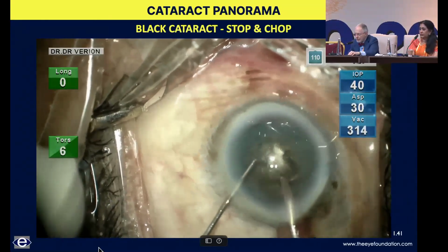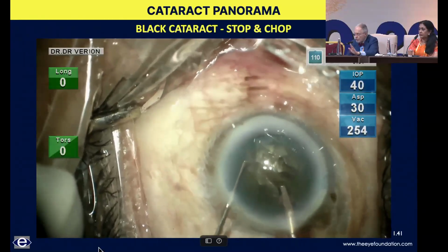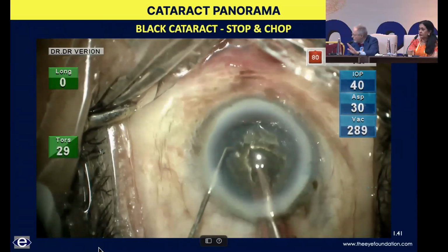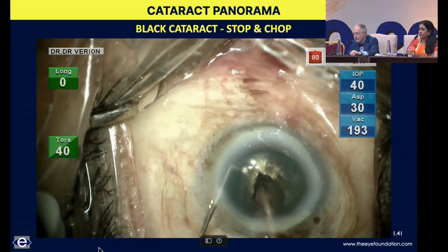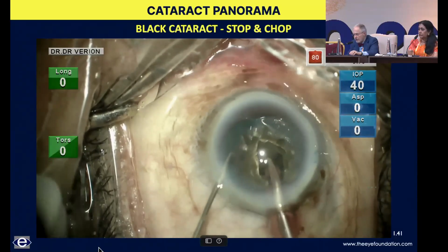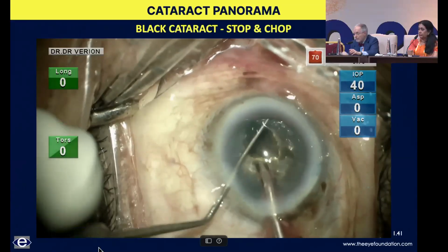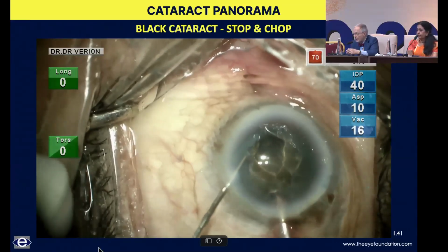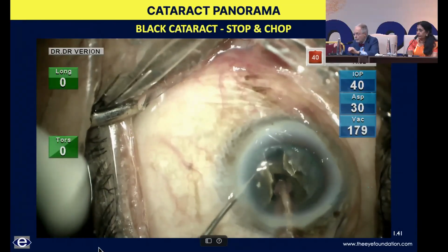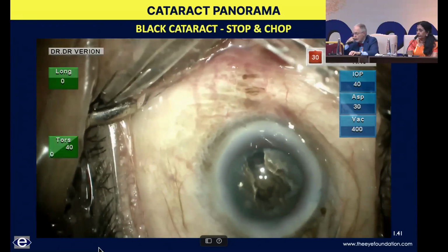Because I like to debulk and get rid of a lot of the hard material when I'm assured that it's in the posterior chamber. And I agree that I like to use a chopper on top when I get to the fragments, but sometimes you can't even crack these lenses very easily, even with a chopper and your phaco tip. And I will sometimes take the phaco tip out and put a Sinskey hook in as a second instrument and just mechanically peel it apart if that posterior plate will not separate. It's a very gentle way of assuring that.